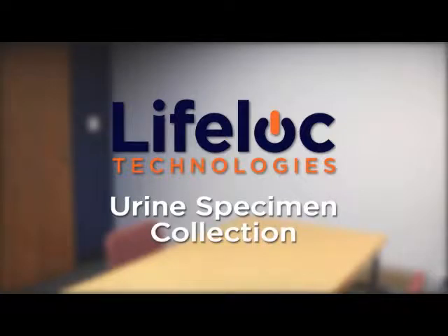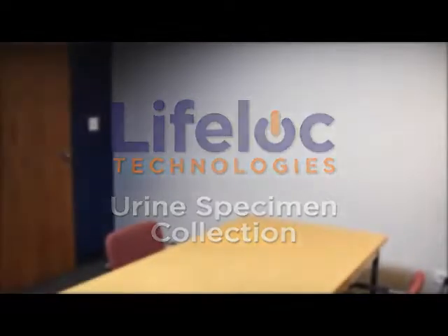By watching this video, you'll be familiar with procedures involved with the U.S. Department of Transportation's urine specimen collection process and how to properly complete paperwork associated with the collection of urine. Let's get started with our demonstration.